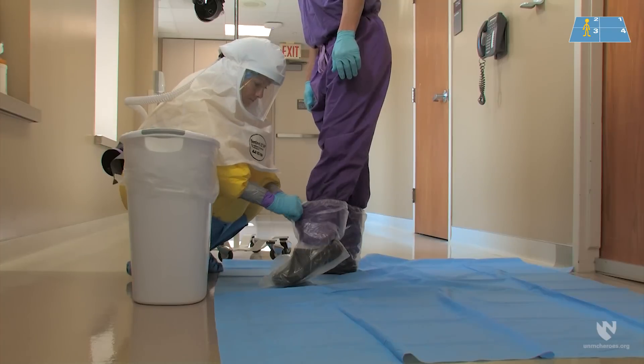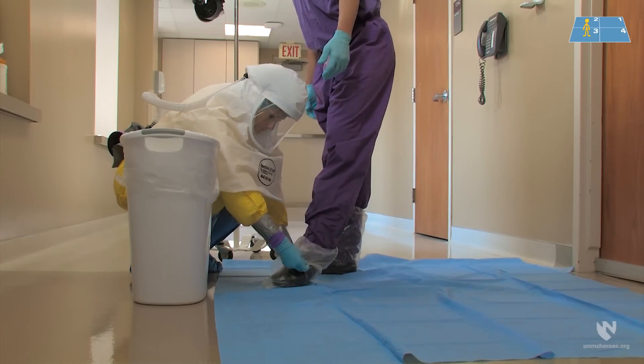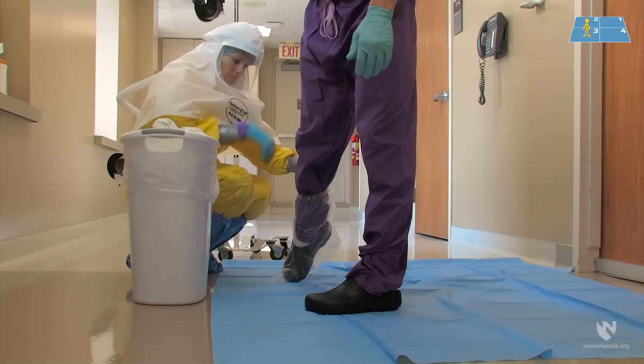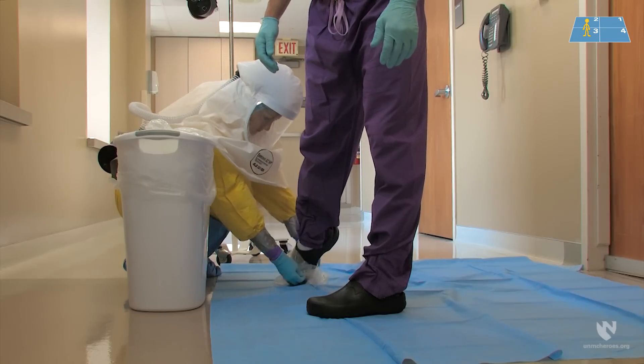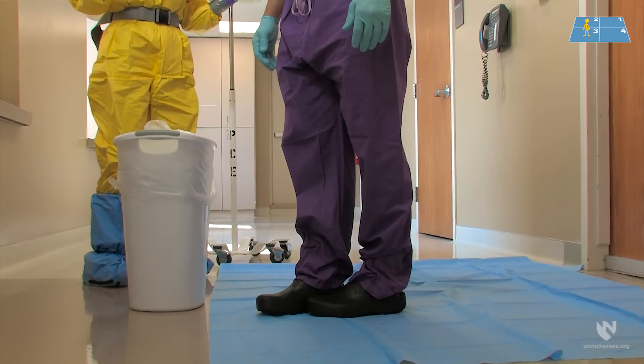The final piece of PPE to be removed are the boot liners. The doffing partner should roll the liner downwards, guiding it gently over the heel and then the toe. Once the first boot liner has been removed, the healthcare worker should step to the fourth clean quarter of the doffing pad, and the boot liner is gently placed in the trash. The doffing partner can then remove the second boot liner, rolling it downwards and removing it at the heel first and then from the toe. With the second boot liner removed, the healthcare worker places their other foot into the clean quarter of the doffing pad, and the second boot liner is placed gently in the trash.